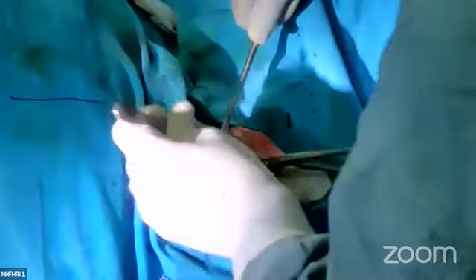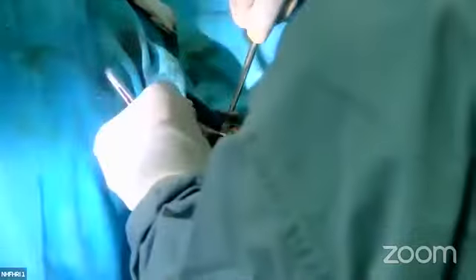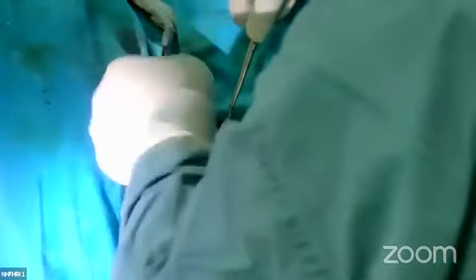So now I am fixing the generator, the battery, with the underlying muscle so that it cannot move down. It is especially important when the person is elderly and lacks subcutaneous tissue. More silk means more chance of infection, so it is better to use a smaller number and amount of silk. Now completed.